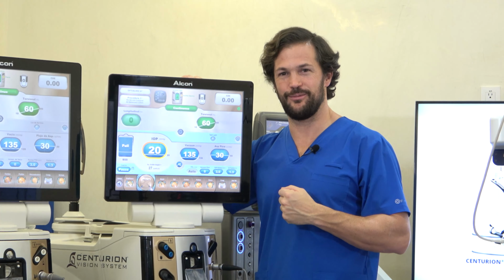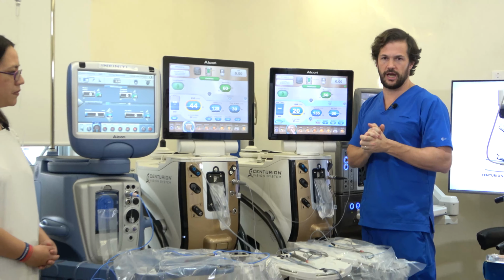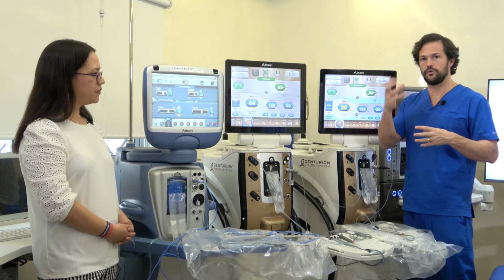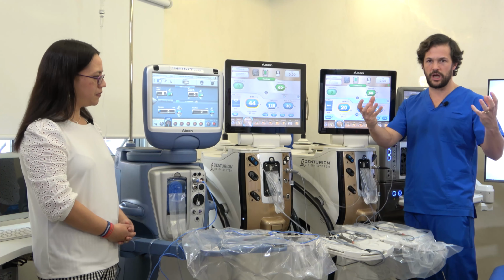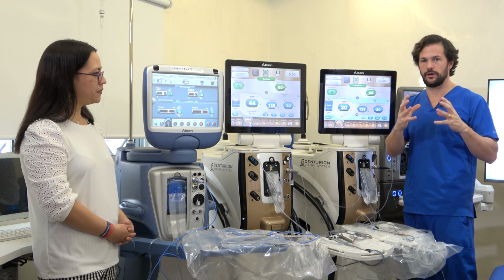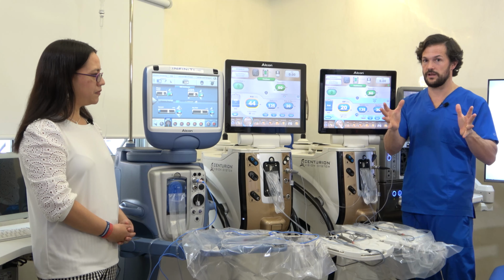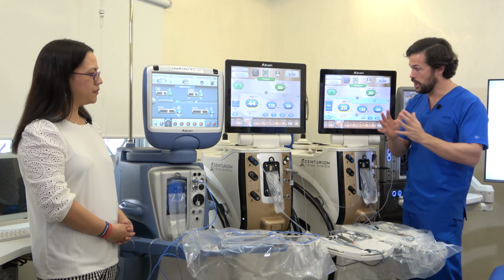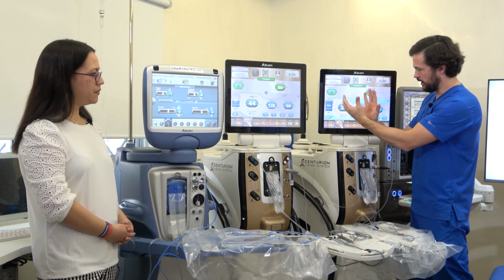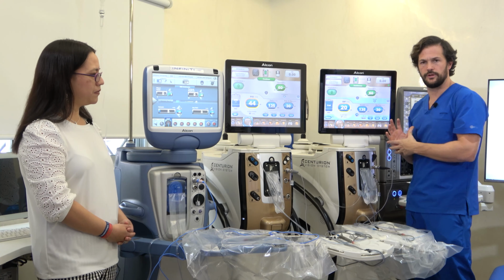So you understand a little bit more about Phacodynamics. One of the important things about Phacodynamics, the most important concept and principle, is you need to balance what goes in, what goes out, and always be careful with the ultrasound, because that's energy that produces inflammation. If you understand that, you're good to go. To do that, we're going to divide what's happening in sculpting and quadrant removal and cortex removal.